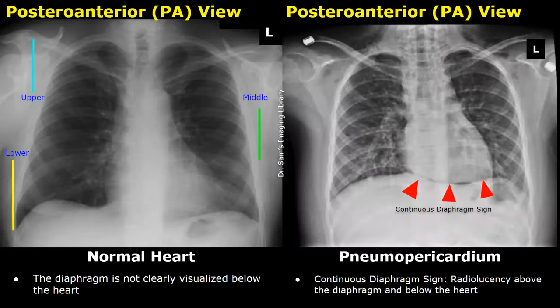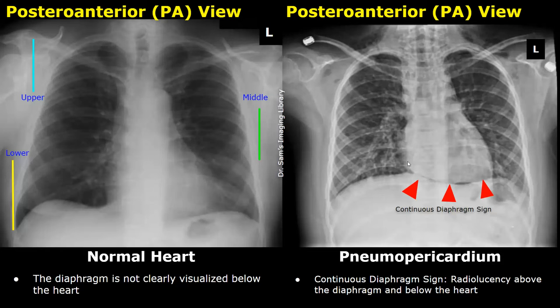Here is another case of pneumopericardium in which a continuous diaphragm sign is seen. This happens when air is present within the pericardium above the diaphragm and below the heart. Normally the diaphragm is not clearly seen below the heart, but here it looks like a continuous diaphragm due to the presence of air within the pericardium.